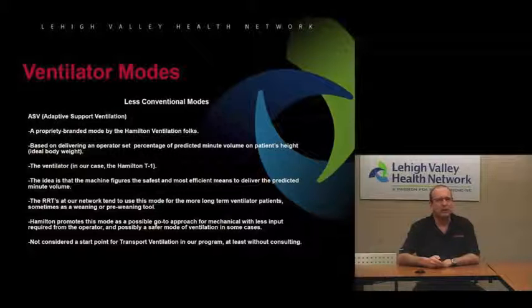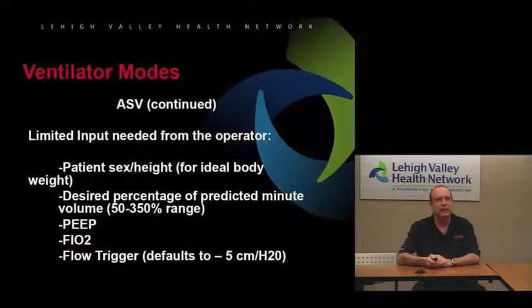It's not really a starting point for us in the transport environment when we're transporting these patients in the acute phase. Now, there are some patients that we do pick up that are already on it, the ones going back to the nursing homes designed for ventilator patients, or the LTAC units. Some of those return inter-facility transfers of ventilated patients are on this mode, and I would think it'd be perfectly appropriate to maintain that.